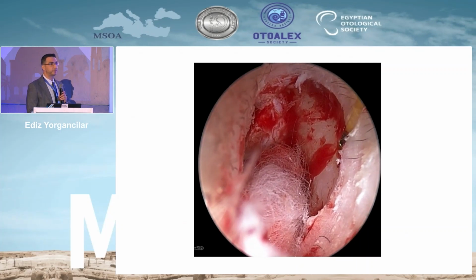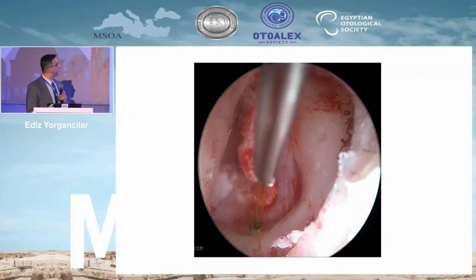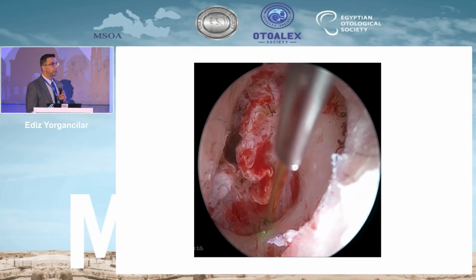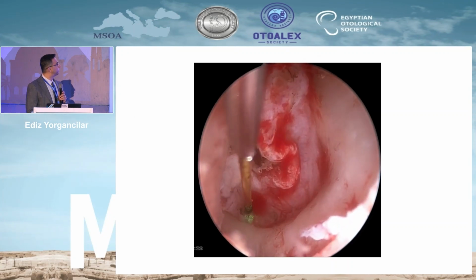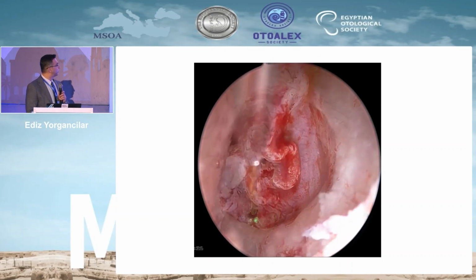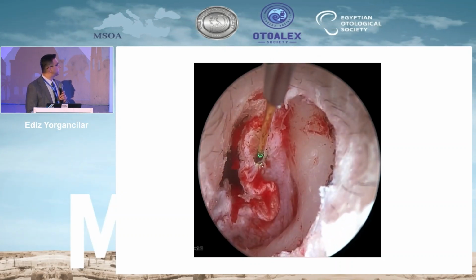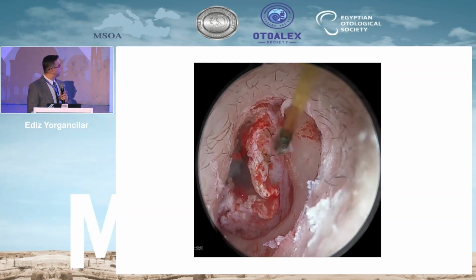During this surgery, some annoying bleedings around the flap or the incision line can be controlled by the coagulation mode of the diode laser, and the assistant resident controls the irrigation. As you can see, the laser touches and controls the bleeding.